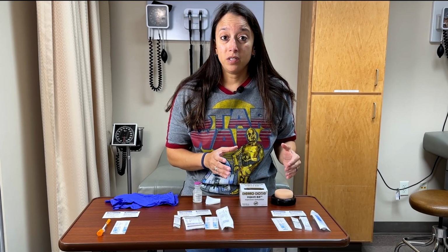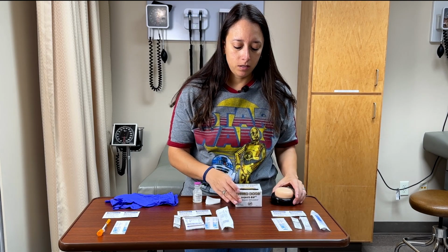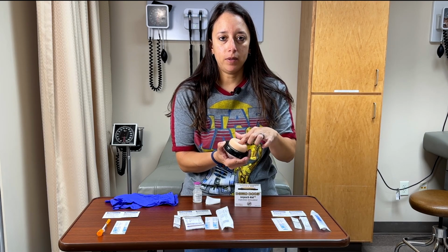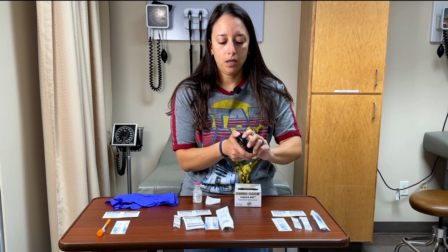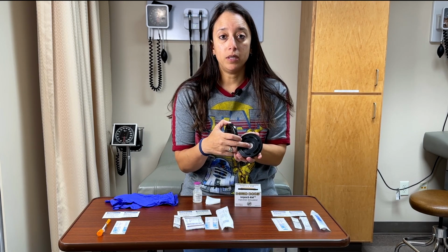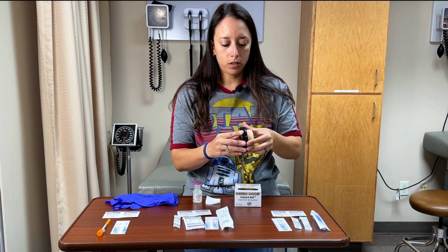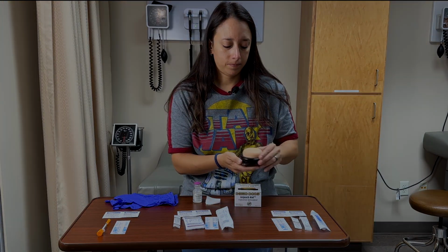So the simulator that we use in our lab is called the demo dose, and it's the Inject Ed. It teaches the students how to inject into a simulation of skin. This is kind of a silicone base, and it has kind of a reservoir or a sponge on the inside. So when you inject into it, it kind of feels like real skin. The other thing is that underneath it, if you open this up, you can see the sponge underneath, and so any liquid that you inject in this will be collected down here and can be disposed of. So this is what we're going to work on today when I show you the different types of injections.